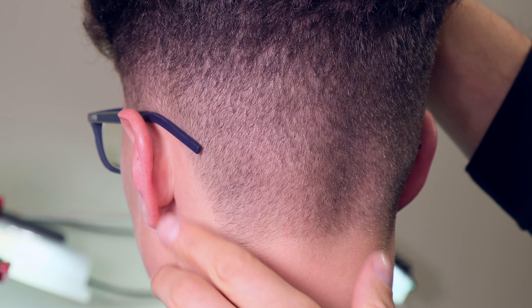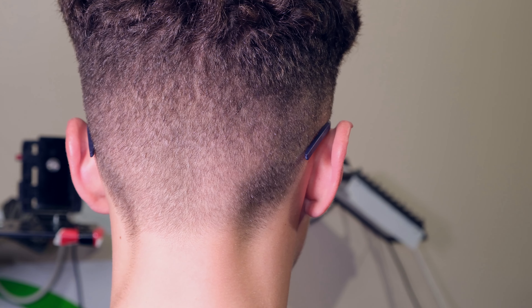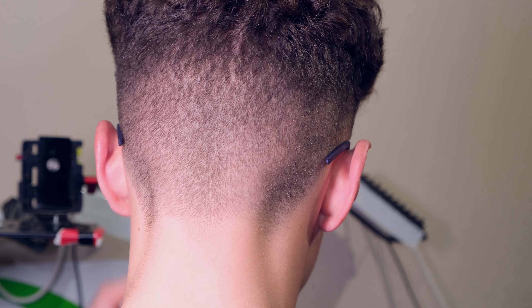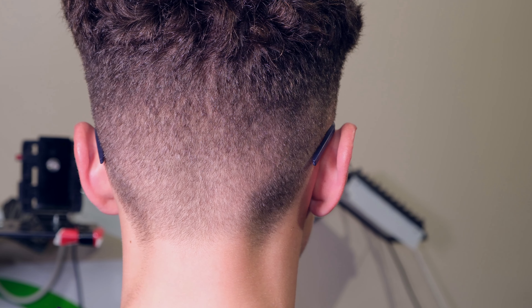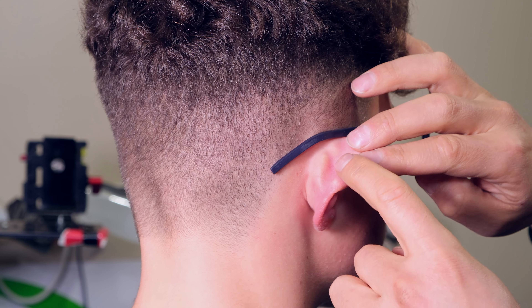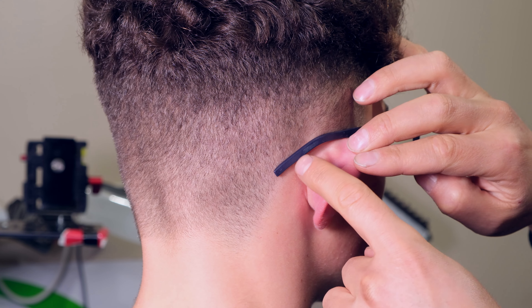This one is flush on the side there and this one is also flush — you can just check if they're comfortable for the user. Take them off, put them on, see if they fall off. In this case he's happy with them because he doesn't want them wrapped around his ear, but if he did, all you need to do is heat up that bend there and then wrap it down. Whenever adjusting the temples just make sure the spectacles are sitting straight, because sometimes when you adjust the sides it can go crooked — you might need to readjust the temples to make sure the spectacles are sitting straight.